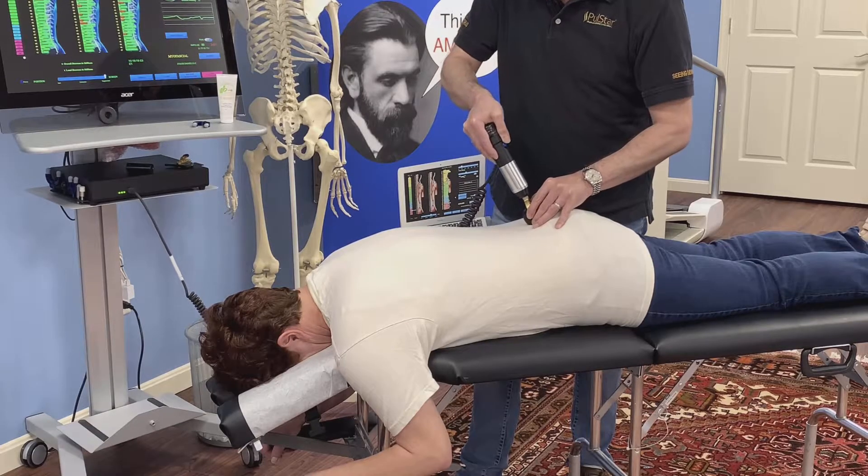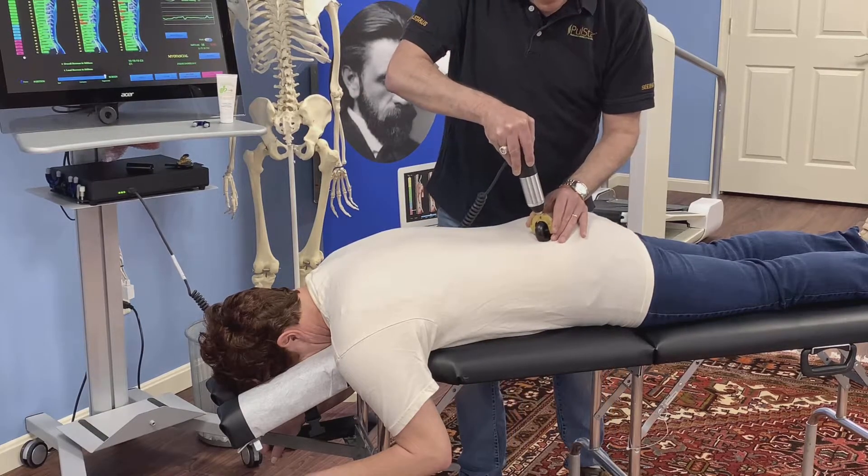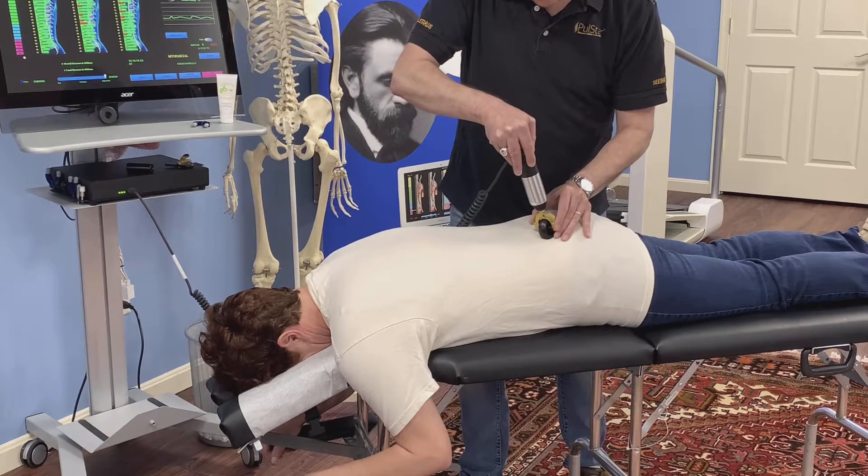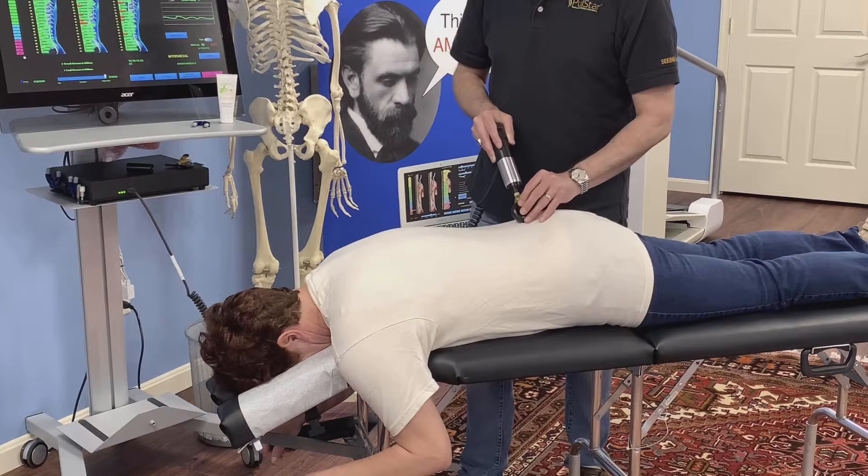Anywhere that I find a very tight area, I can just roll back and forth through that section and relax those muscles very easily.